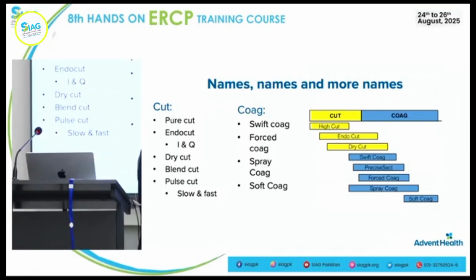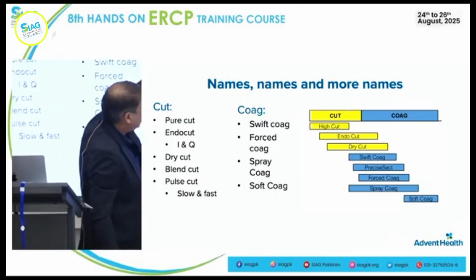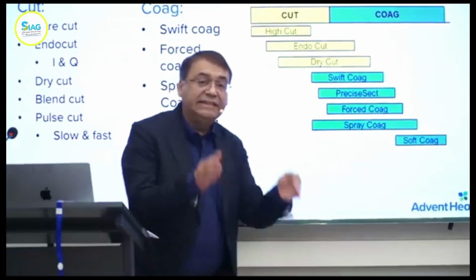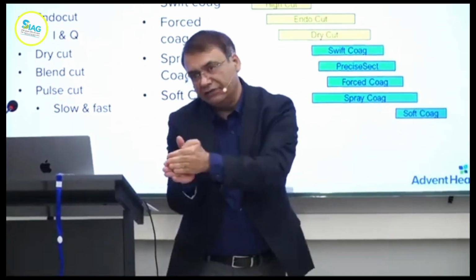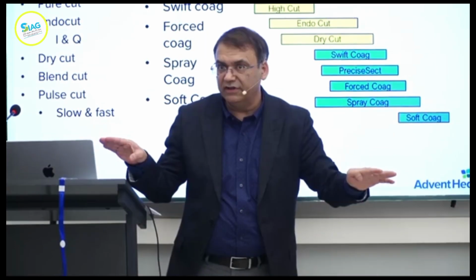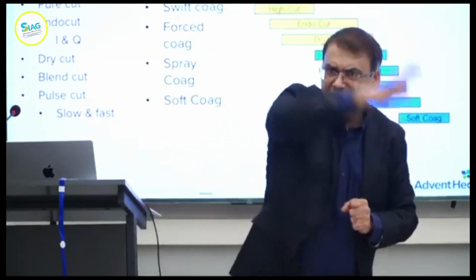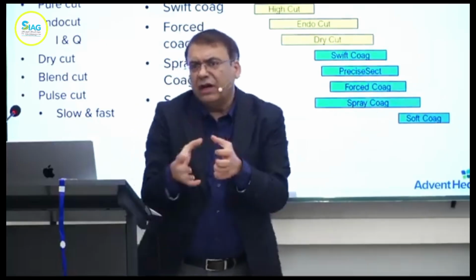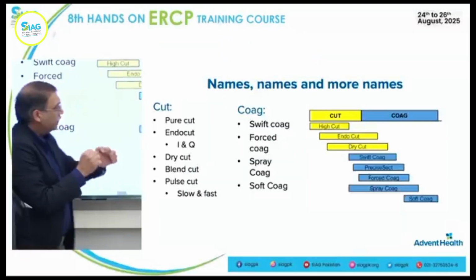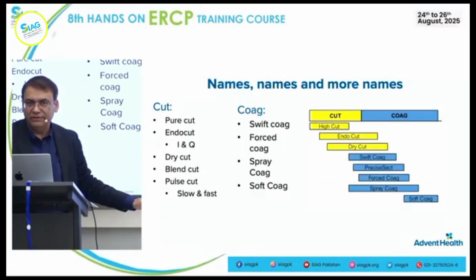This one. You see so many names on one slide. So cut, coag, everything else in the middle. And that really depends on how much of the cut current is in there and how much of the coag is in there. That's the only difference. So yeah, it's all that physiology, really good, but at this level in medicine, I think it becomes really hard for us to understand that. So this slide is the whole electrosurgery we basically use.